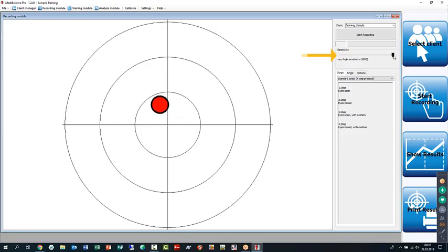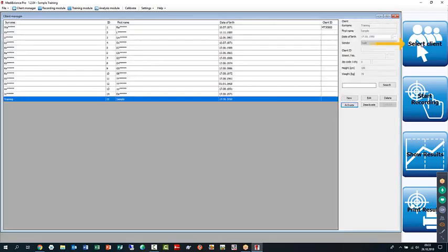Now it's so sensitive that even the slightest movement in the room already shows on the platform, as you can see. Now the platform is next to me, and if I touch it, it immediately goes back and forth. So I don't have to have the body weight with it, but I can actually use it for hand therapy as well. We're going back to average, which is 24. And again, your standard routine is you select the client, done.